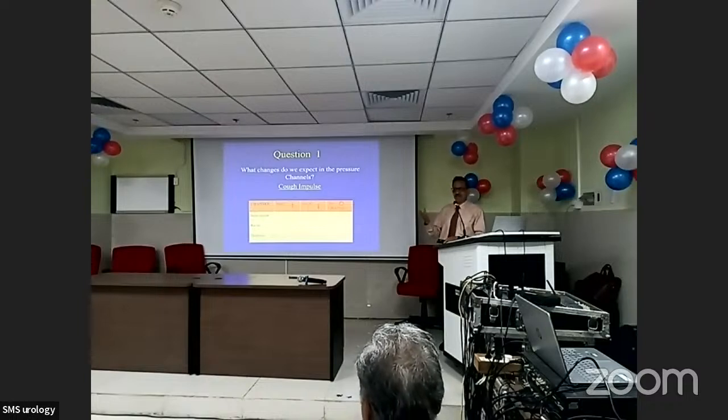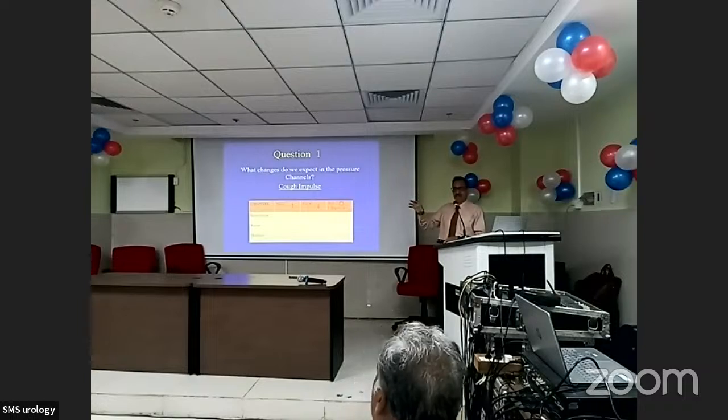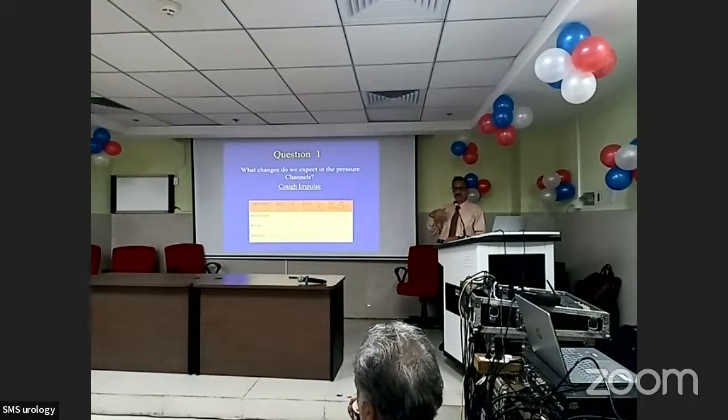Because intravesical pressure is the summation of detrusor pressure, generated by detrusor contraction, and the abdominal pressure acting over it. You want to subtract that component from the intravesical pressure, so that you will know your detrusor pressure.